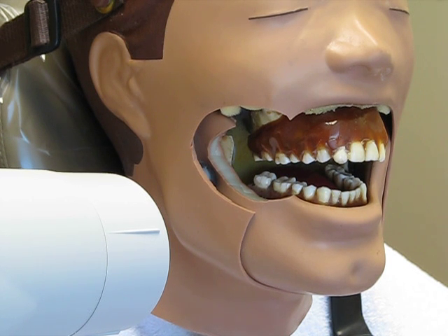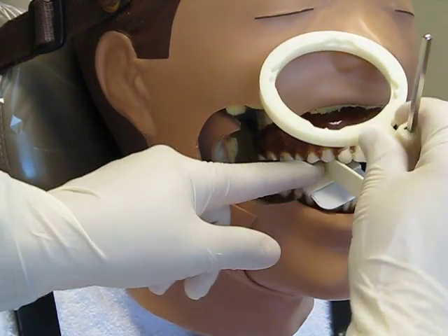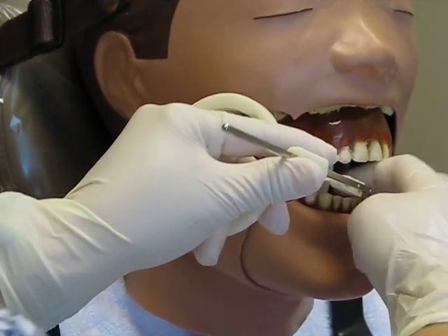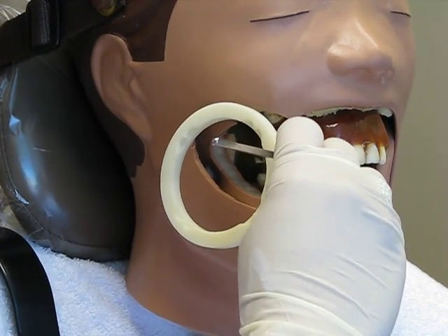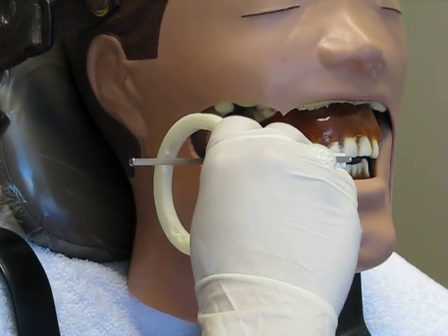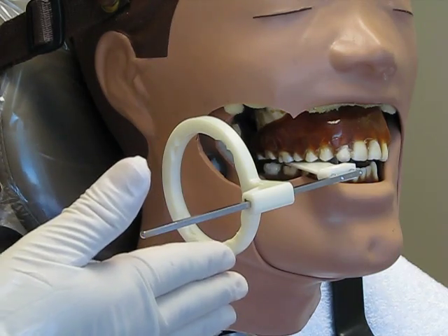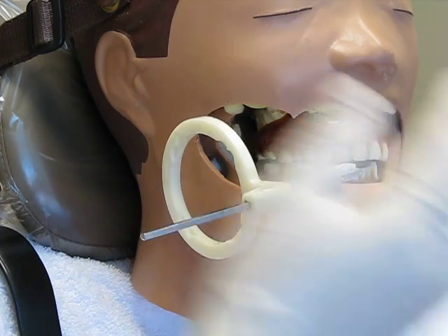So again, I open by squeezing the top, which you can't see in the video, but I will do that. Move this out of the way for now. Place it in carefully. Gently move the tongue out of the way for the mannequin. I'm going to start with the molars, so I'm going to position it, make sure it's parallel in there. Have them bite down as much as I can, have it come out parallel. Again, this doesn't always work, okay? So you just got to know the concept.